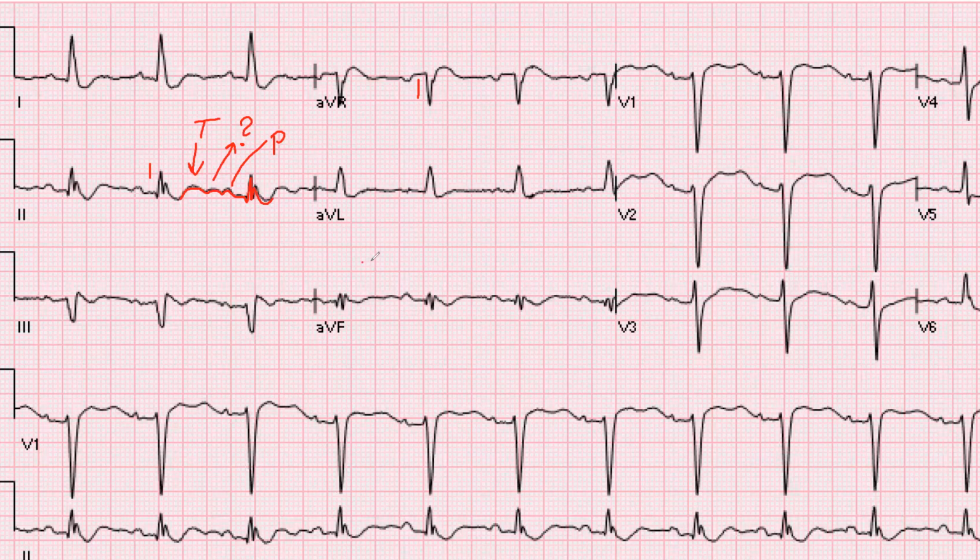All right. I'm drawing this ECG pattern. Okay, this is a P. That's a QRS. That's the T. That's something. That's the P, and the QRS. P wave, T wave, P wave. Do you know what kind of wave can be between T and P? I'm not sure. Anybody? Is that an atrial extra? Nope, nothing to do with the atrium.